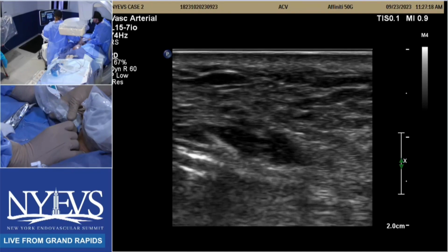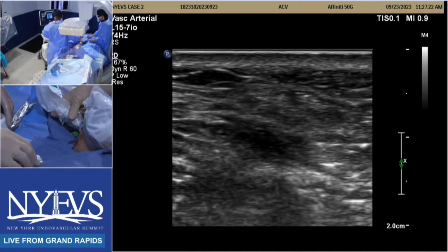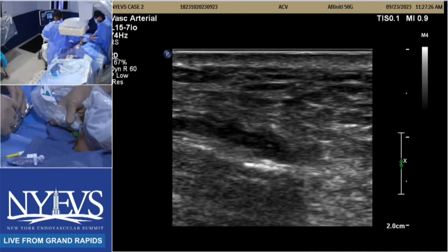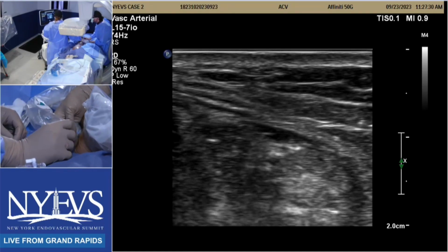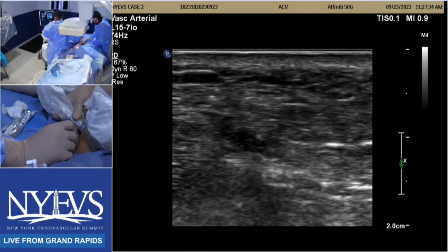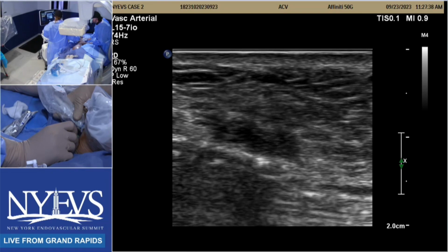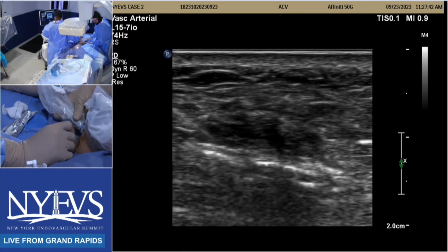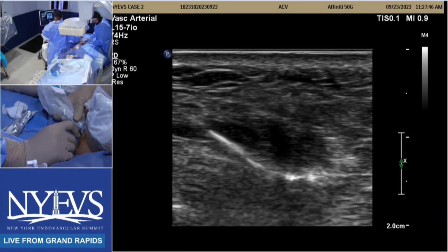I agree completely. The only thing I will say is that we do hybrid quite frequently when we do femoral endarterectomy and then things distally, but we also do hybrid when we do distal bypasses. So if we thought we could bypass potentially to that AT, then once you expose the AT, you could open it up below the ankle from that area, making it easier to do. And if you got that loop open, then it would be a viable target. It's a great point, Anahita. A new way of thinking.